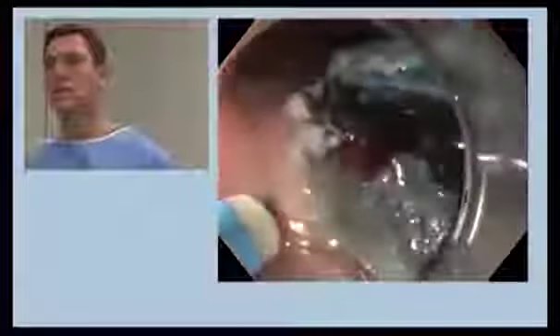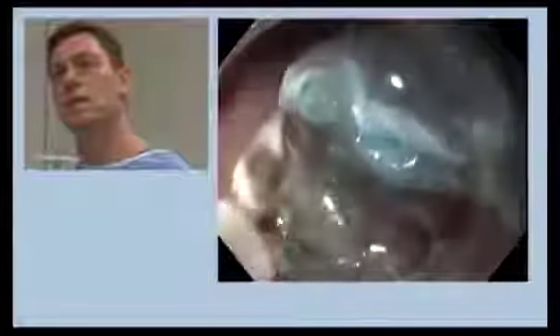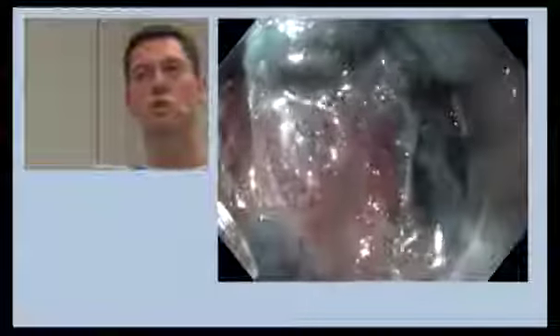Of course, you do have to be really careful always to keep taking time to work out the layers themselves. Because the further it goes downwards, the more cicatricial it gets. And we mustn't be tempted to try and work fast. Here, there's certainly a venous plexus underneath. And there you have to cut very, very carefully, so you're not spending half your time coagulating the bleeding. But we can cut this out here.